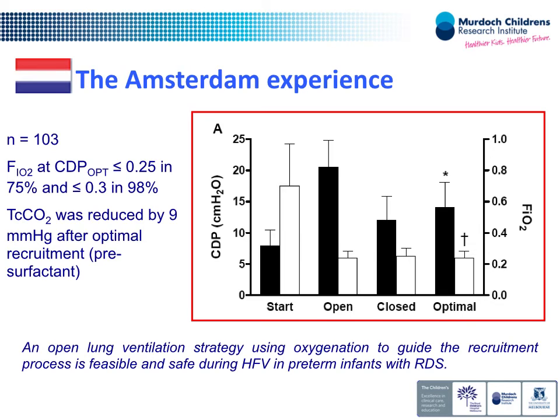And the failure here is more than 40% or more than? Sorry? You consider CPAP failed at more than 40% oxygen requirement?